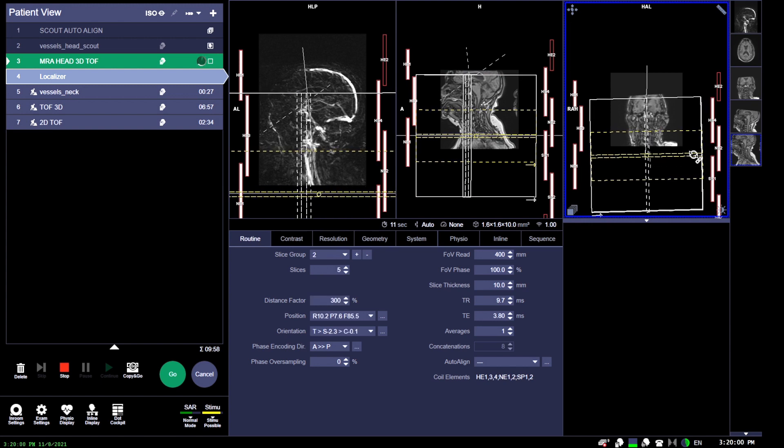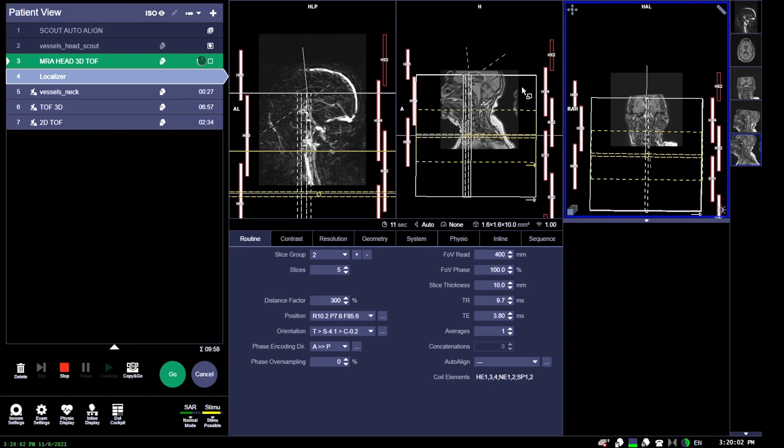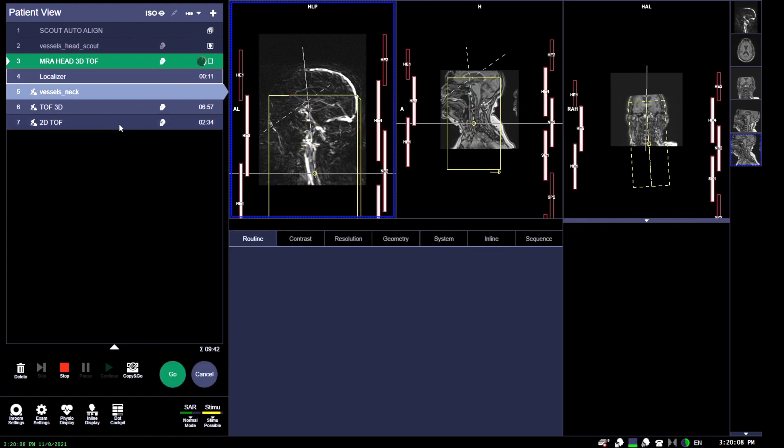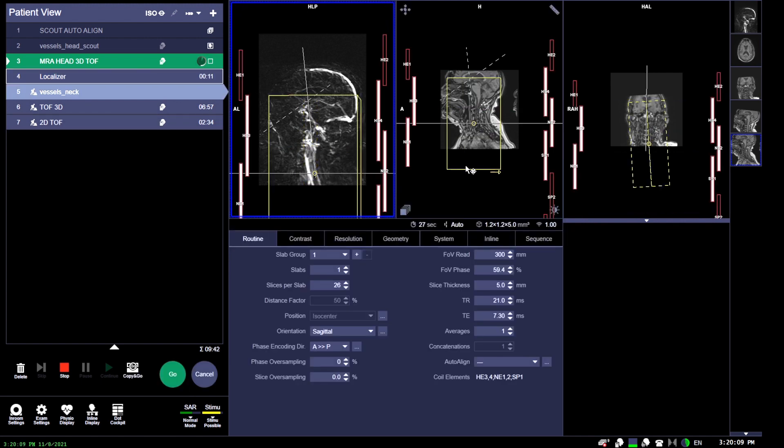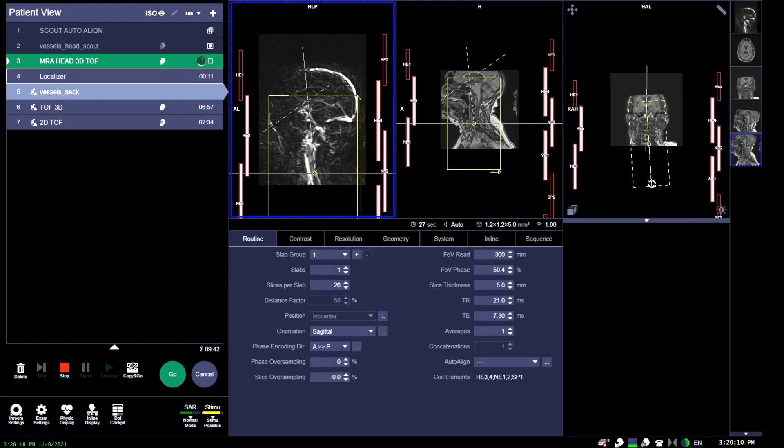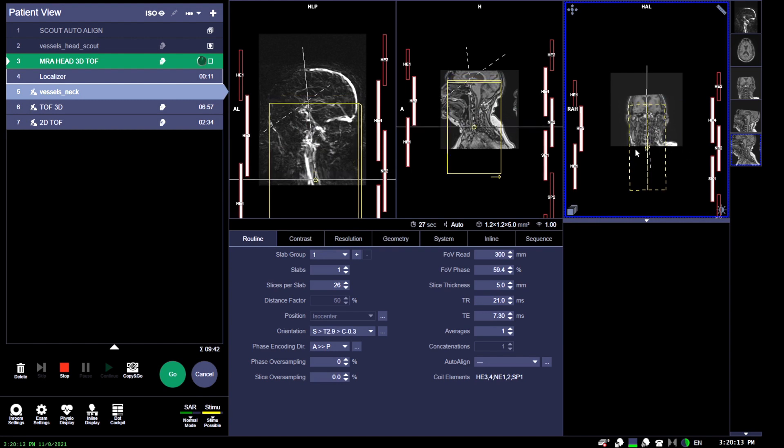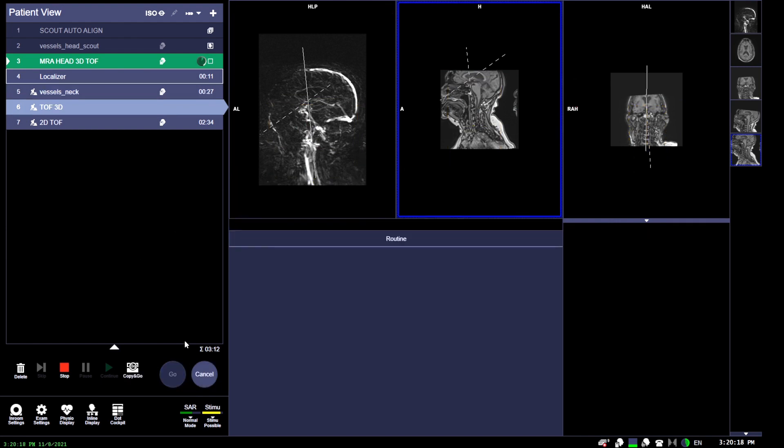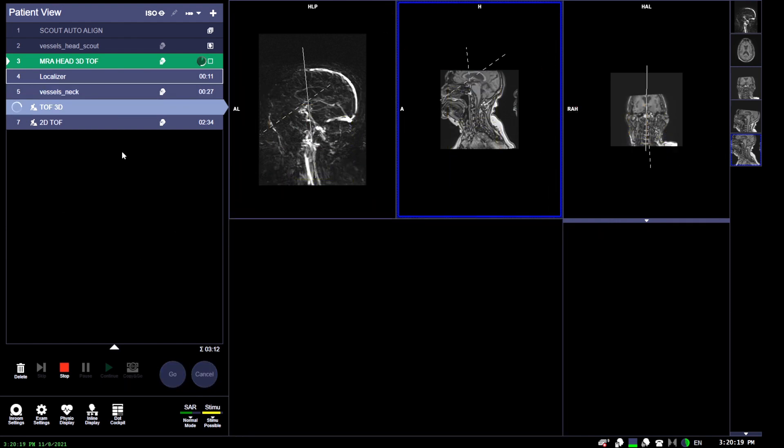Some parameters for the MRA brain: field of view of 22 approximately, slice thickness of 1.2 overlapping, locs around 4, locations per slab is like 32, you can do a matrix of 256 by 160 depending on the site, a TR of around 23, a flip angle of around 25. Make sure again that you want to have that saturation band on the superior part of the head here.